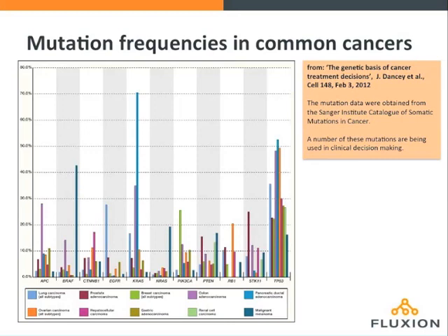But what I'll be focusing on today and showing data from is our KRAS assay in particular. We just chose that gene because it's well known, has clinical utility in the primary tumor, and is a tumor that's fairly common to a large number of cancers.